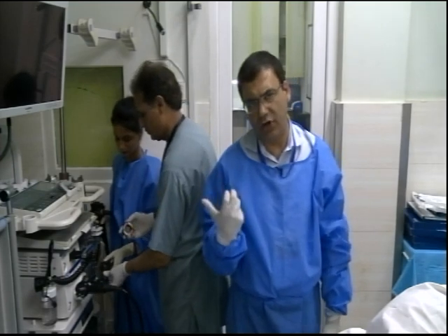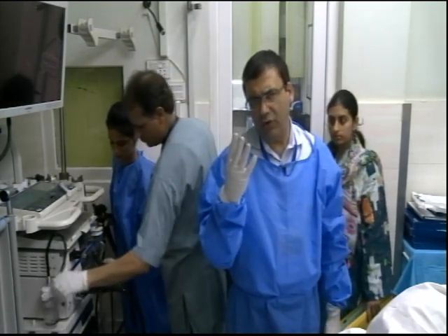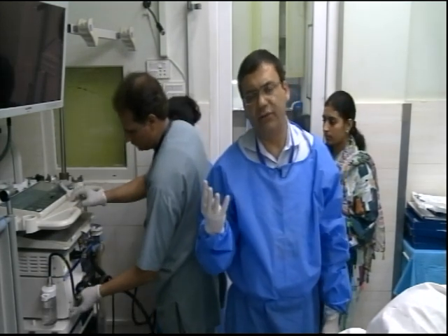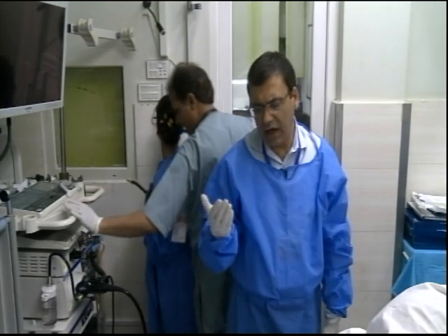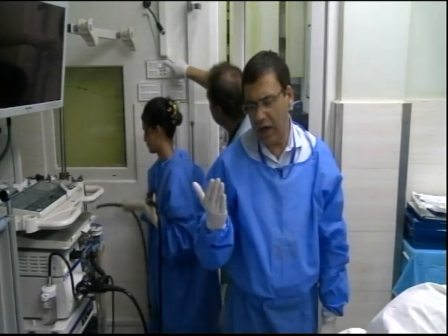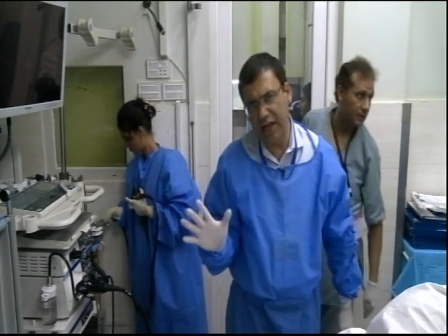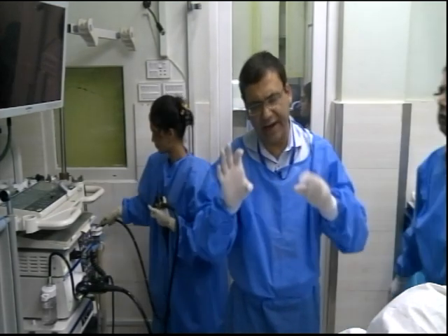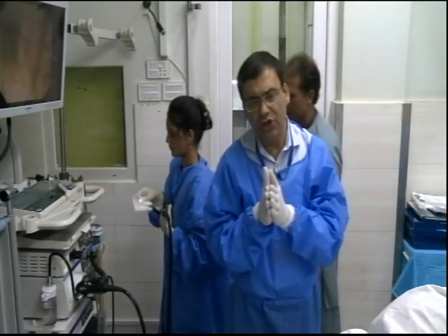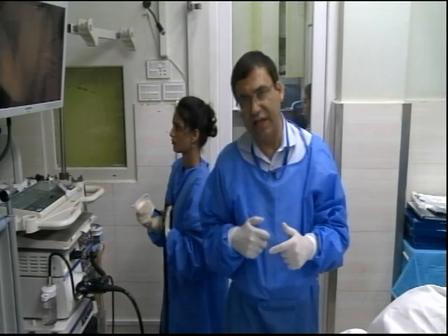It's not really 100% correct. Actually, its accuracy is around 50% or so. The reason is we have explained the 4 layers before: mucosa, deep mucosa, submucosa, muscularis propria, and then obviously serosa outside. With chemo or radiation and chemo, there is a destruction of the tumor that leads to inflammation. That inflammation leads to activation of fibroblasts and scarring. So the distinction between the layers is usually lost. You have to keep that in mind. So it usually ends up overstaging rather than understaging.